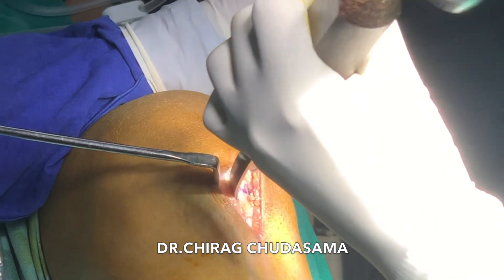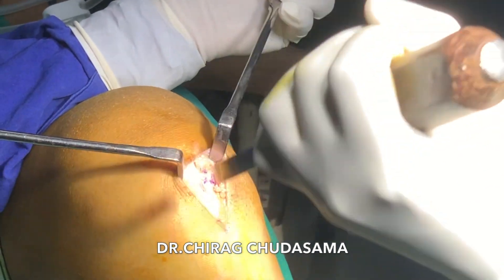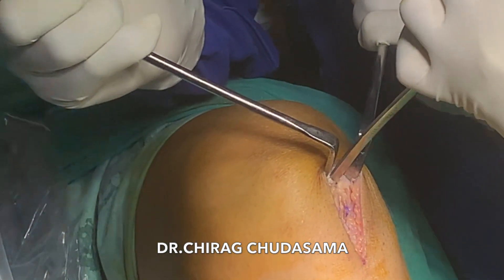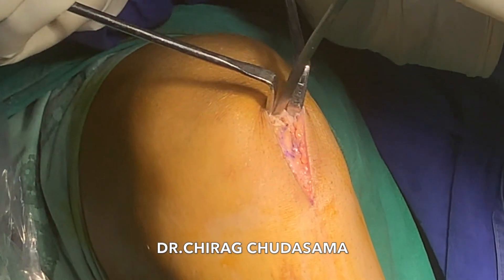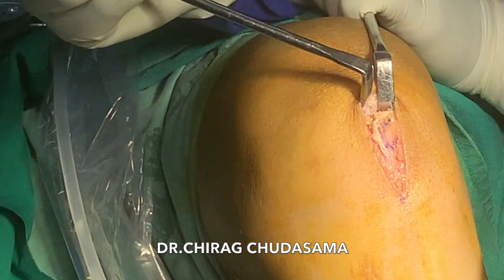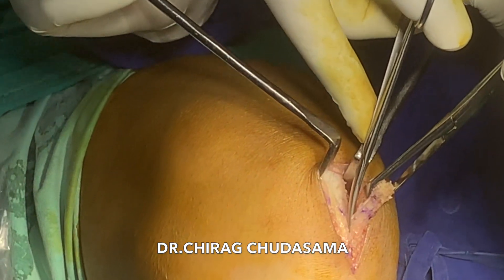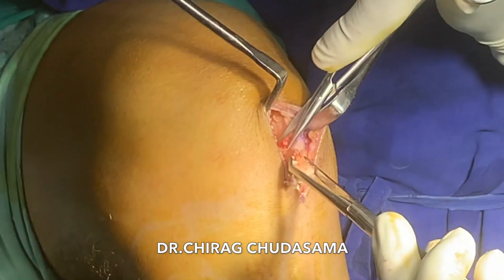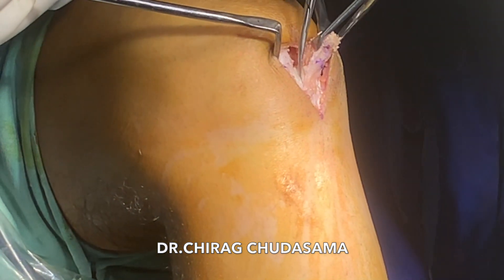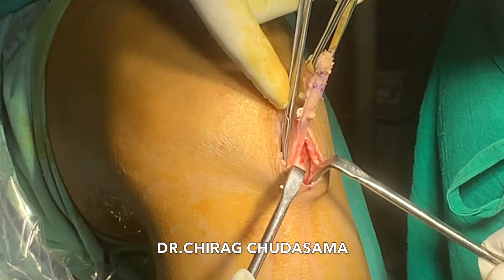Again medially and laterally, you just need to ensure whether the osteotomy is complete on the patellar bone plug side. After medial and lateral osteotomy is complete, I use an 8 mm curved osteotome proximally to separate the bone plug from the parent patella. This is how you can beautifully harvest the patellar bone plug — I always harvest the patellar bone plug first. Then you grab the harvested bone plug with Alice forceps, complete the splits on the patellar tendon, and separate it from the surrounding tissue and underlying fat pad. You trace it down until you reach the tibial tuberosity. This is how you can see the beautiful harvest of the central third of the patellar tendon.